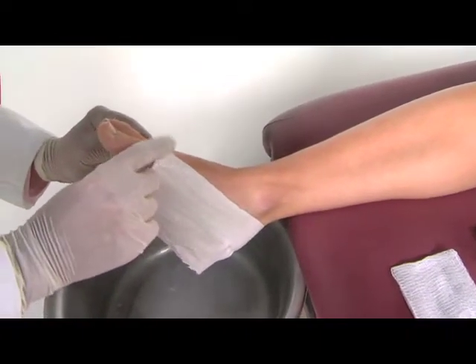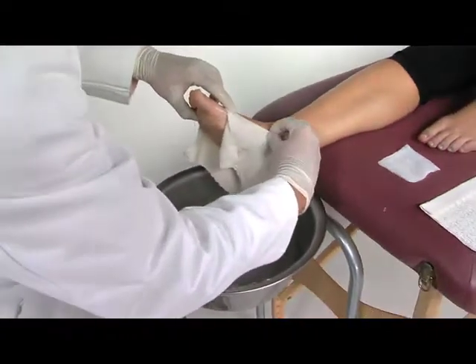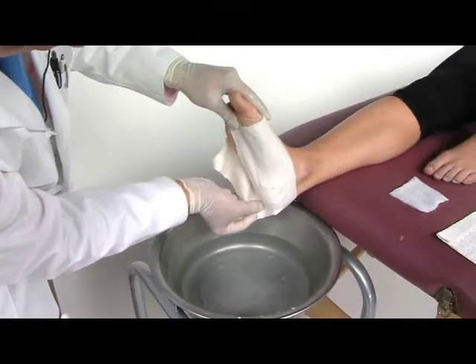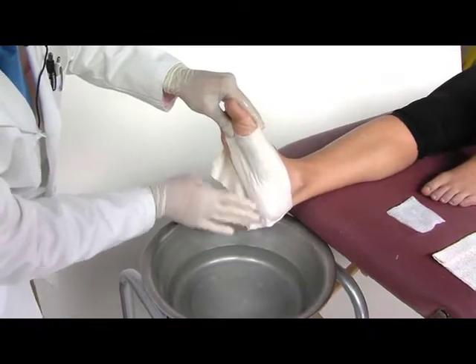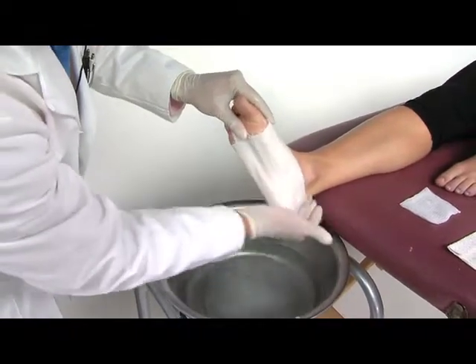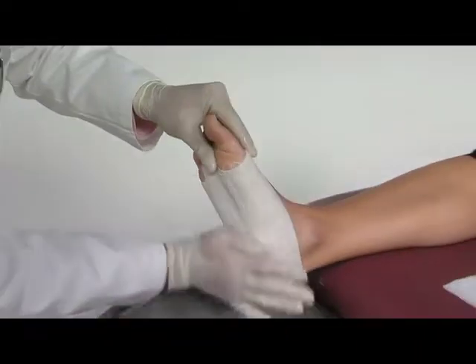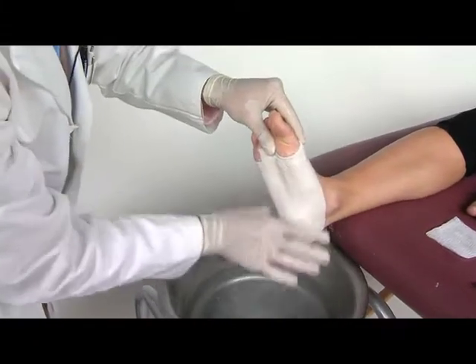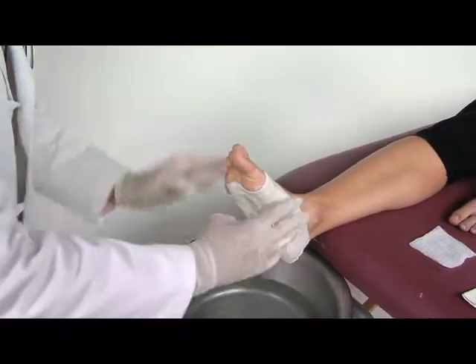Take the middle of the plaster splint — top and bottom middle, and also the left and right middle — and put her heel right in the middle position here, thinking about wrapping her foot in entirety. Put the end of the plaster right here along her first metatarsal head, and the end right along her fifth, covering up here and pulling up along her navicular just a smidgen. Tack it in here and smooth all this out so it's nice and creamy right up against her foot. Take the other side — the lateral side — push this over, tuck that little fold in the back under like this, nice and smooth. Then push the inner space between your thumb and index finger into the lateral arch and use your index finger into the medial arch right in this position.